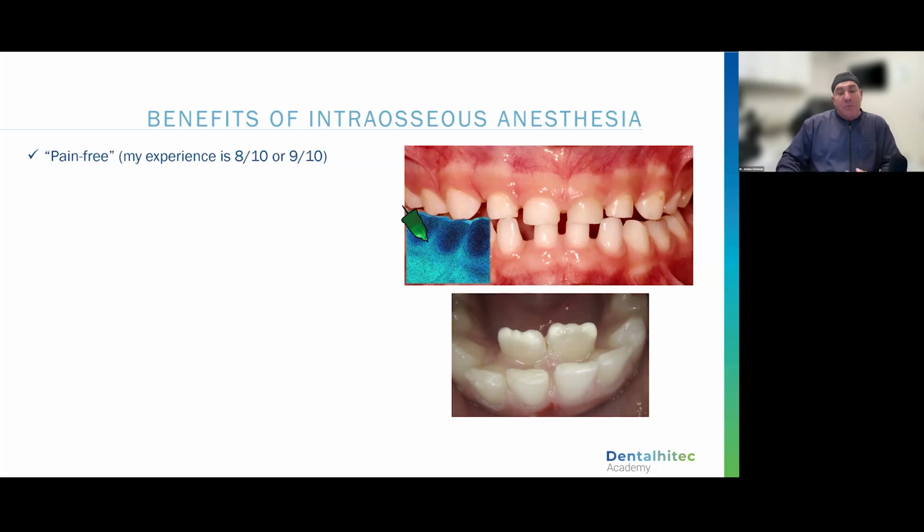Right now, I may have a patient react, they may feel a little pressure, but if I follow all the steps and I follow the rules that we go over with you tonight, I will tell you that it's not just my experience, but all the other KOLs and experienced users find that most patients don't even react. My goal is to give local and the patient didn't even know. And the parent is just staring at me.